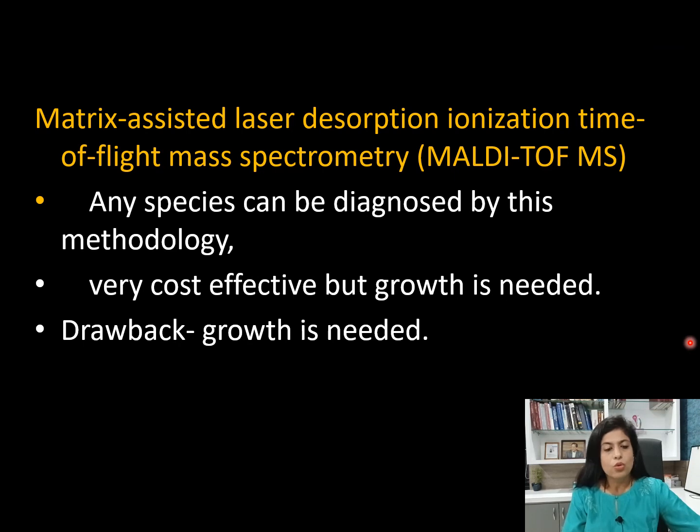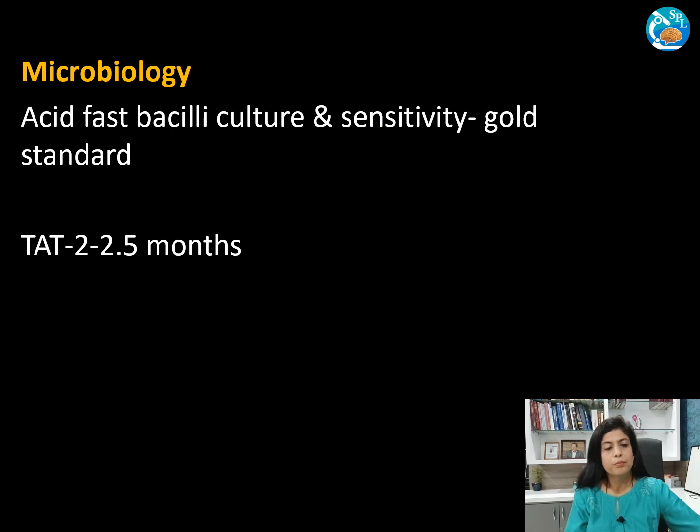Now, this is a technology called matrix-assisted laser desorption ionization time of flight mass spectrometry, that is called MALDI-TOF MS. One can detect any species based on this methodology. It is very cost effective, but the drawback is one needs to have a growth for this method.